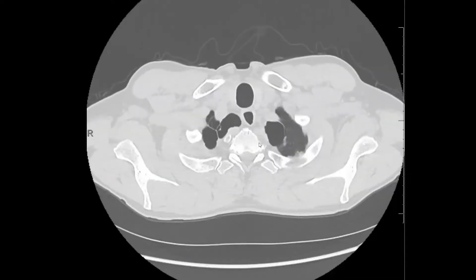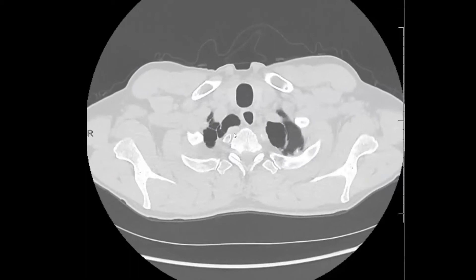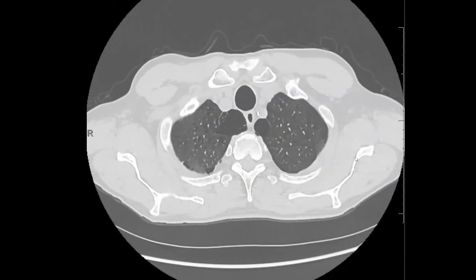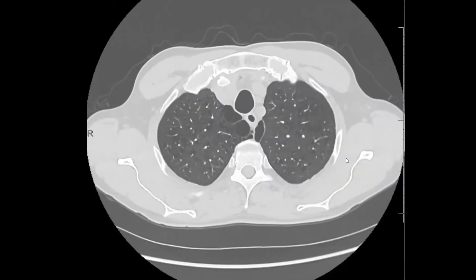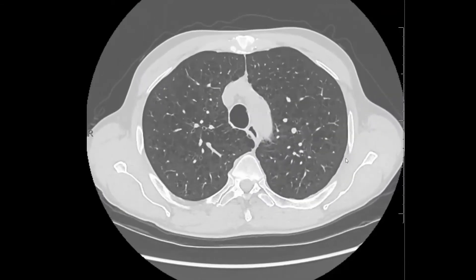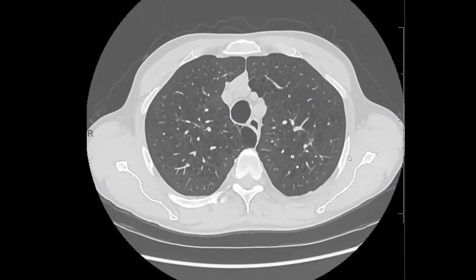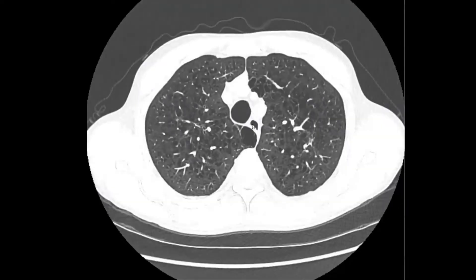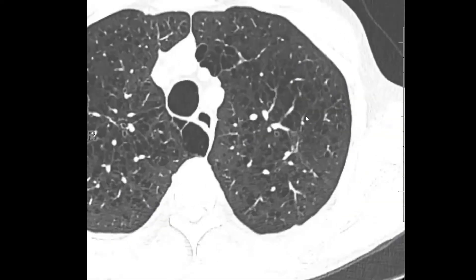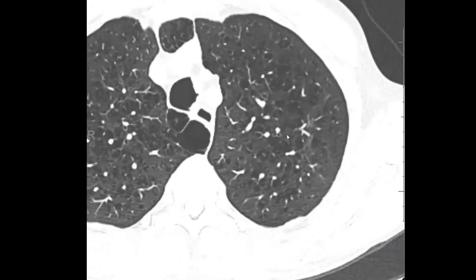Here we have a nice example of paraseptal emphysema. As you know, paraseptal emphysema involves the upper lobes most commonly — the apices — usually smoking-related. And whenever you see paraseptal emphysema, it's very common to also see some centrilobular emphysema.